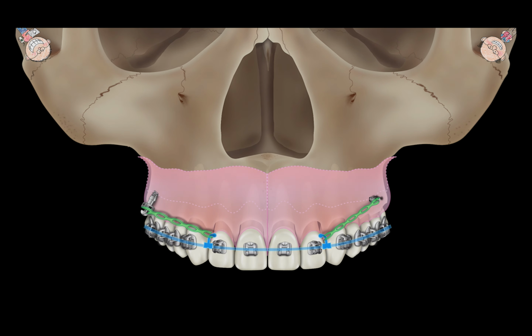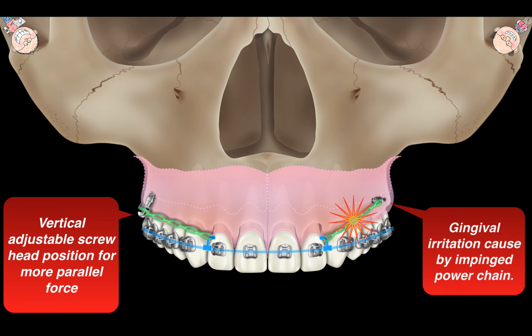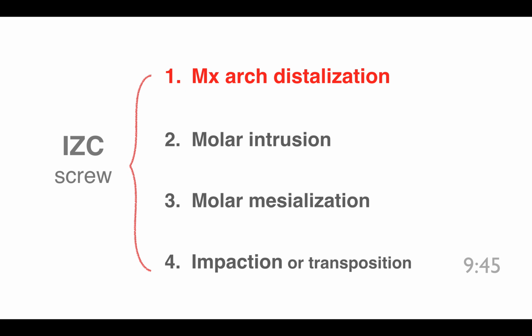A work of art. So with that, you'll be able to change the force direction. In the other approach, you cannot. And it's easy, with that approach, to poke into the soft tissue and damage the soft tissue.